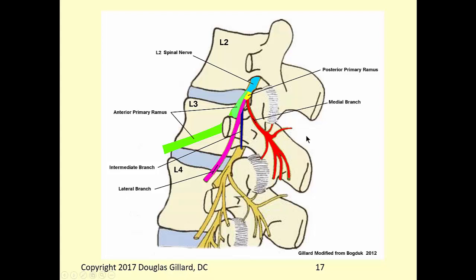It's important. Why is that important? Well, what if you're going to have a fusion, and the surgeon wants to know: are you going to fuse the L2, 3 together? Do you need to fuse the L3, 4 together to test it? Because maybe this facet joint is so bad you can't stand the pain. You have to fuse it so it stops moving.